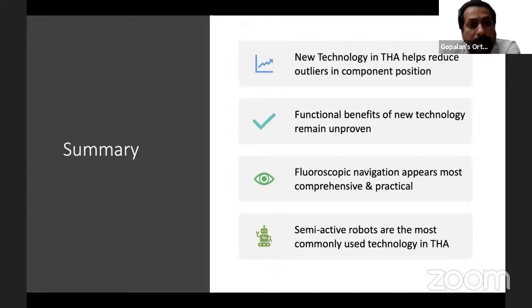Okay, thank you, Neeraj, for that. The other question is, the bigger issue, the number of complications are slightly higher in a total hip replacement, isn't it? If you look at dislocations, slightly higher when you compare with knee, because knee is a much safer and more reliable surgery. Yes. So do you think the cup positioning is where new technology should focus? Because still in the data you presented, more technological advances happen in the knee rather than the hip. Don't you think the hip is more important?